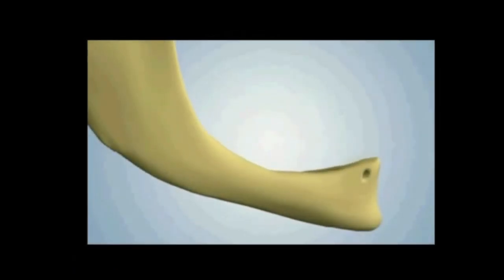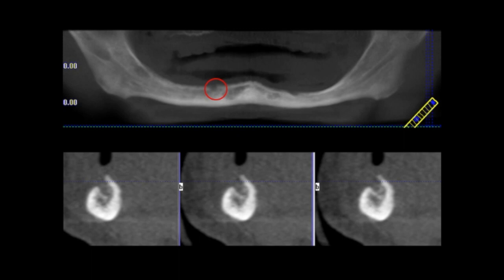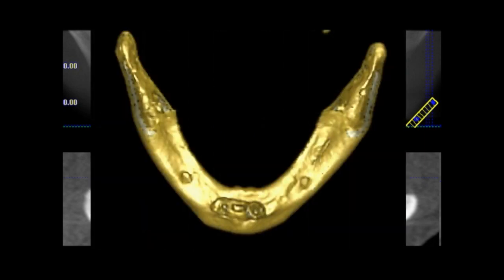Due to the resorption of the mandibular crest, the mental foramen can be situated directly over the crest, as seen on this panoramic reconstruction, the cross-sectional reconstructions on the right and left sides, and on a CBCT reconstruction where we can easily see the position of the mental foramen over the crest.